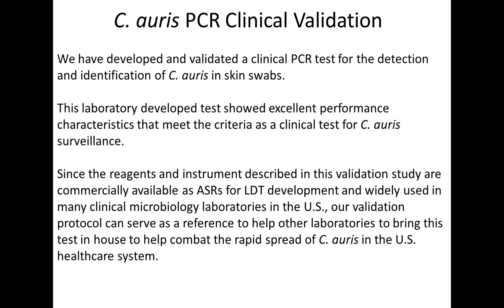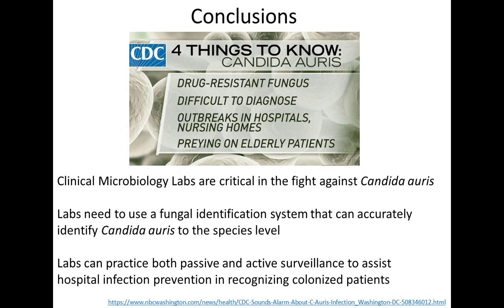The laboratory developed test showed excellent performance, and we hope that since the reagents and instruments described in this validation are commercially available as ASRs for LDT development and widely used, many other clinical microbiology laboratories could take this on, use our validation protocol, and then bring in their own in-house PCR.